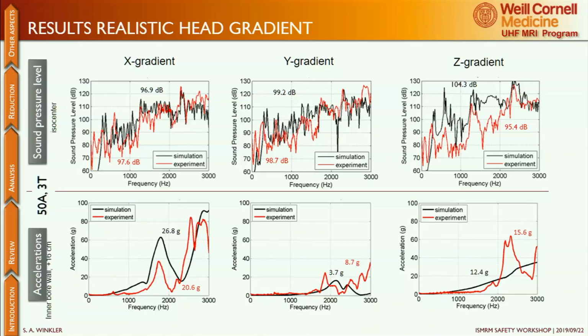So what we did was we added ceramic liners in simulation. You can see that here. The 20 millimeter liner that's shown here resulted in about 17 dB reduction, and we can also see, I think, the higher frequency band was attenuated more than the lower frequency band, so those are also important findings. Then we simulated some more.